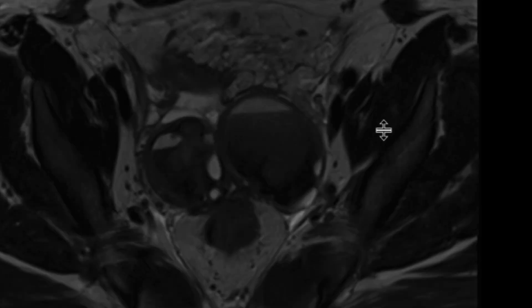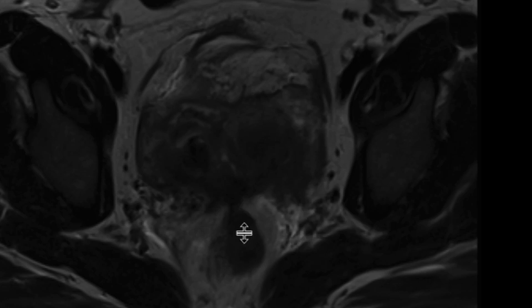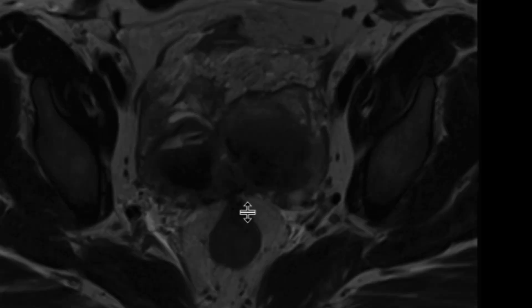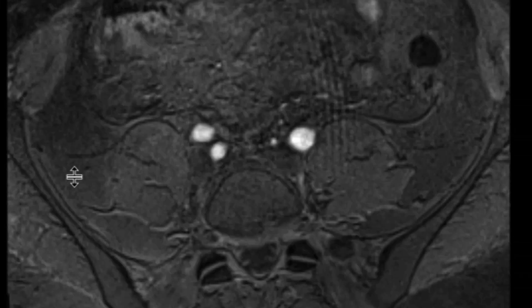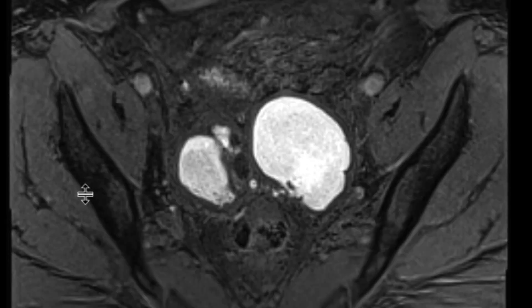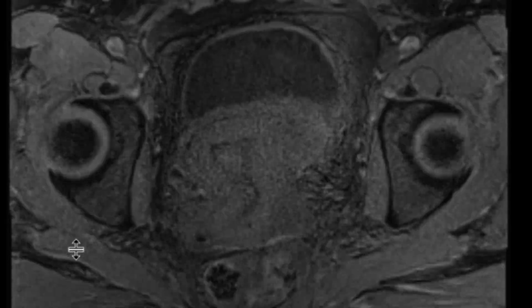We can also get the sense that both these adnexal ovarian masses are sort of tethered to one another. Looking at the rectum and the sigmoid colon, right around this location there is a dense adhesion — a spiculated T2-hypointense mass interposed between this loop of bowel and both adnexa, as well as the posterior aspect of the uterus. On the T1 fat sat pre-contrast images, there is bright signal within much of these lesions within the adnexa, within the ovaries and surrounding tissues as well.